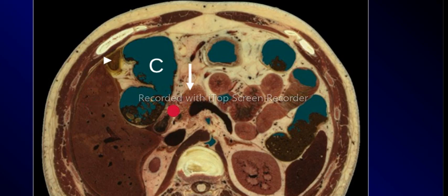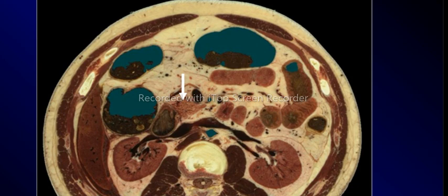This is your spleen, and this is your splenic flexure, small bowel. This is your hepatic flexure. And then this is gallbladder towards the fundus. Further down, the liver is almost gone, small amount left. You can now appreciate the internal anatomy of the right kidney. This is your left kidney. This muscle here is the psoas.